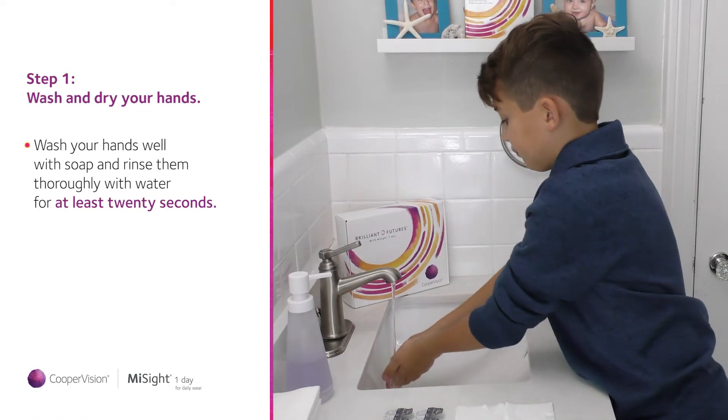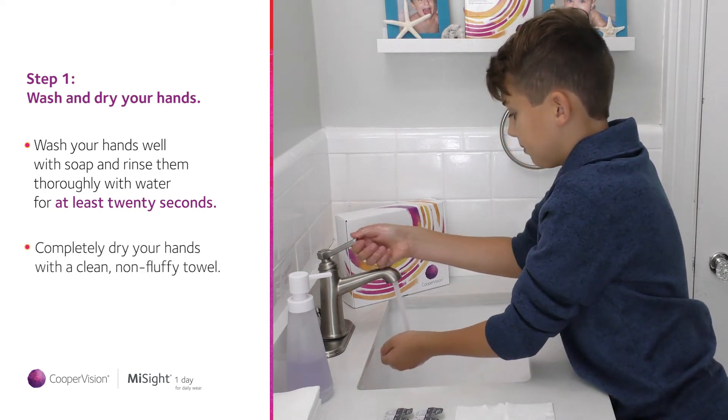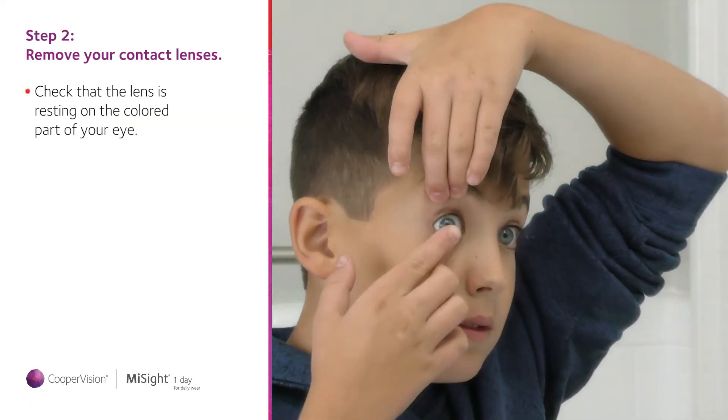Wash your hands well with soap and rinse them thoroughly with water. Now completely dry your hands with a clean, non-fluffy towel. Look straight ahead into the mirror and check that the lens is resting on the colored part of your eye.